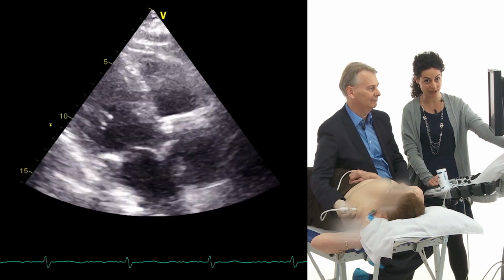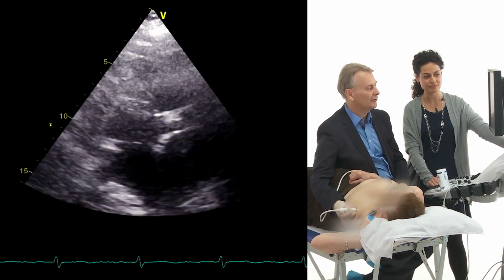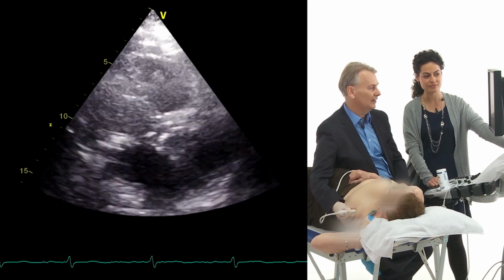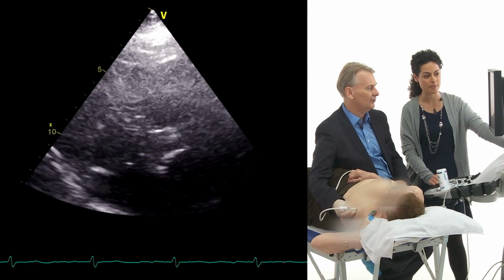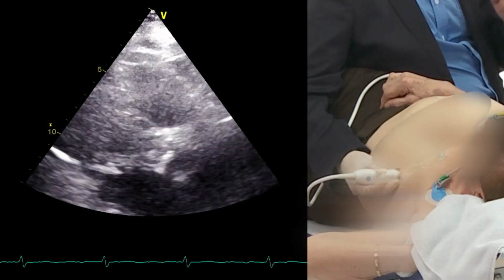It stays in the aortic valve. Right, so the question will be, is this really her problem? Does she have aortic stenosis? So the degree of calcification will be important to look at. And the valve is calcified, but still the cusps open. Yeah, I think so too. There's some opening of the cusps, very difficult to see, but I will go to a short axis view.